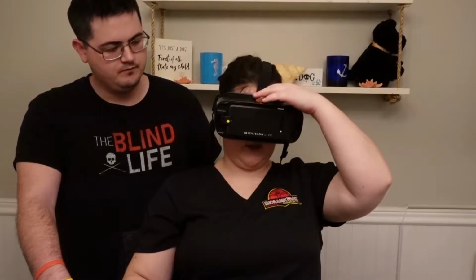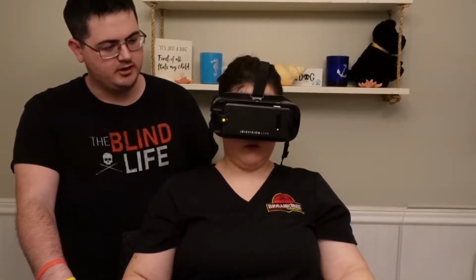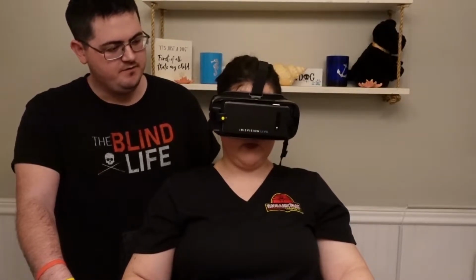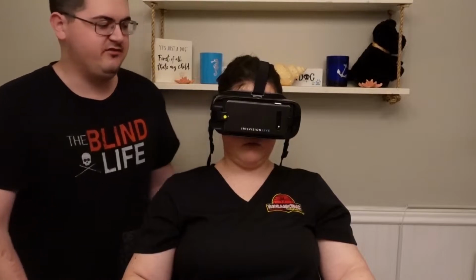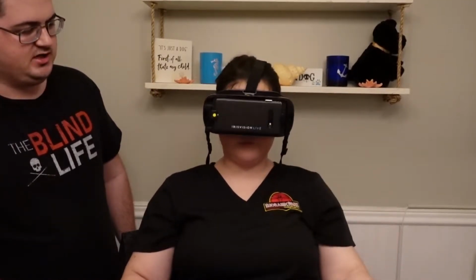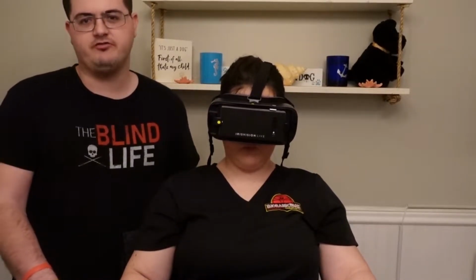I think I like it, right here. Can you see the chairs? Uh-huh. Can you see the bold letters? Yes. It's not too in or too out. Nope, it's perfect. All right, we're going to leave it there for now. If we go to a different mode and we need to change the focus, we will. But we're going to use that as our benchmark for the device.